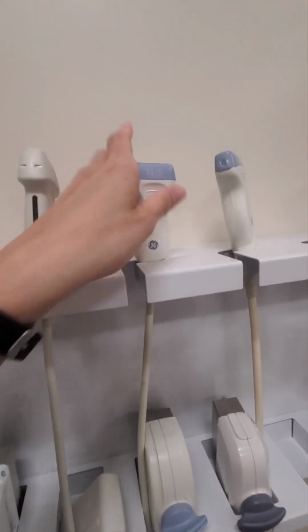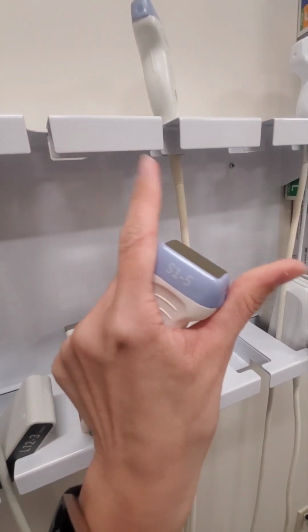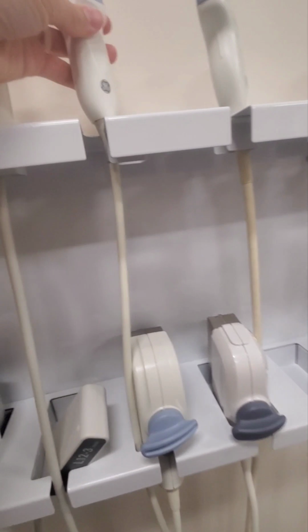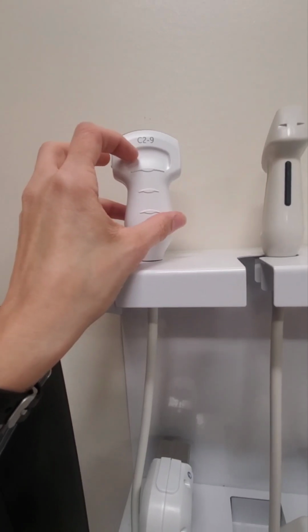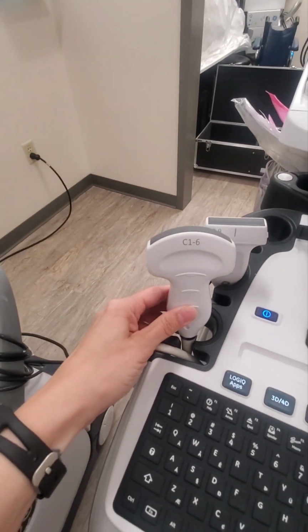And there's sector transducers. These are the ones that Echo uses more. These are really good for peeking through little spaces and peeking through like ribs. Okay. And then again up here, curved. This is a smaller footprint and it's a higher frequency than the larger curved.